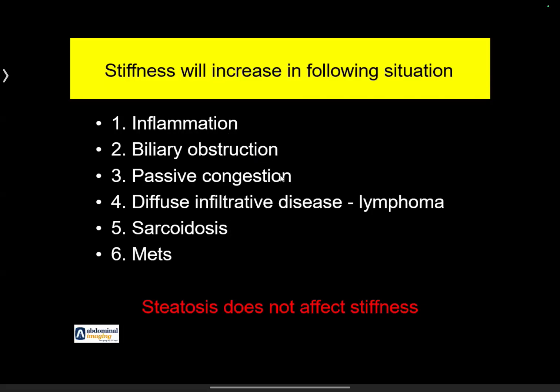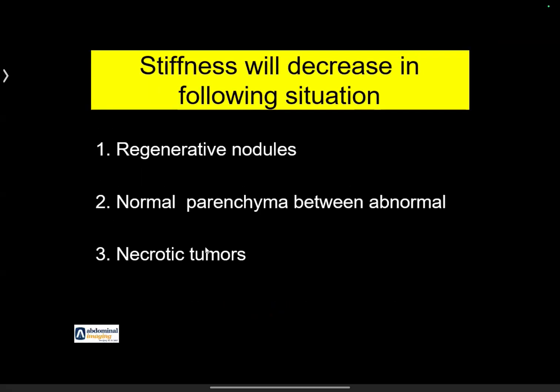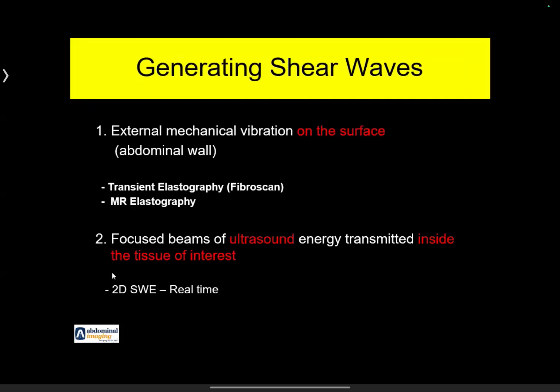Inflammation, biliary obstruction, any congestion of the liver, like say Budd-Chiari or cardiac cause, diffuse infiltrative disease like lymphoma, sarcoidosis, and metastasis. The blessing is that steatosis does not affect the stiffness. Stiffness decreases in regenerating nodules, the normal parenchyma between the abnormal areas, and in necrotic tumors.